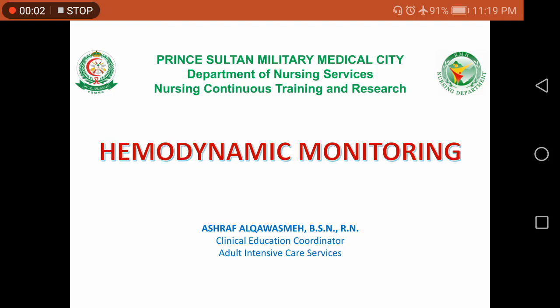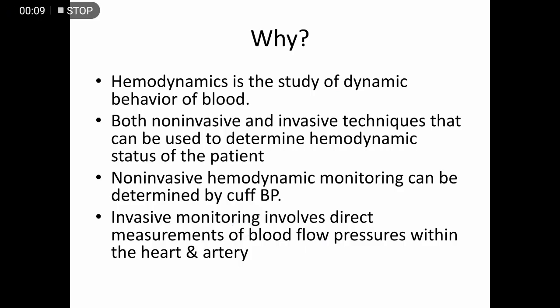In this session, we will be discussing hemodynamic monitoring. Why is hemodynamics important? Hemodynamics is the study of the dynamic behavior of blood. Both non-invasive and invasive techniques can be used to determine the hemodynamic status of the patient.